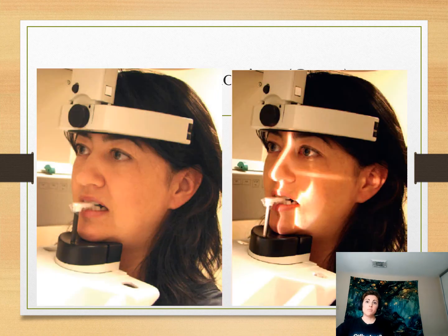Okay, so here is a woman placed in here. You can see here she doesn't have any of the little lights that show up. With our panoramic, they show up as little red lines on it. And so what you'll do is you'll make sure that she is biting. See how her front teeth are falling into the little notch here on this bite block. Once you know that that's happening, you'll have her close her lips and swallow, or close her lips and fill her mouth with her tongue.